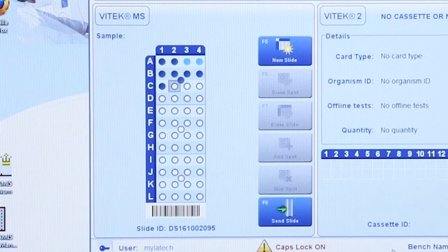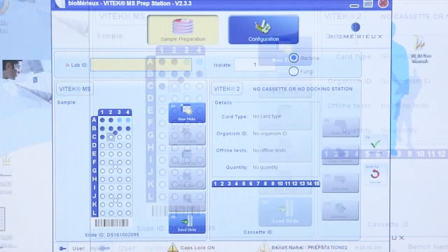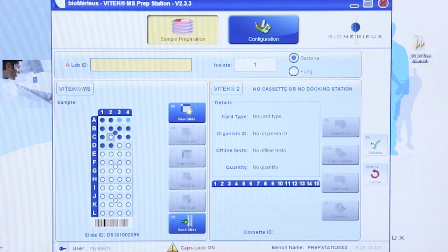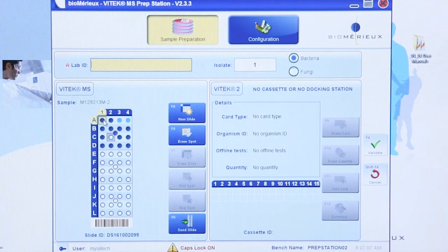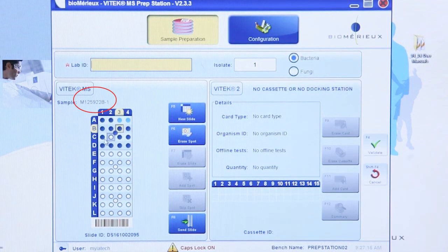The software is programmed to fill the slide in order, left to right and top to bottom. Continue adding specimen information for all isolates to be tested on the slide. Once all spots have been prepared and information entered, it is good practice to verify the data entered. Clicking each spot will display the lab ID and isolate number associated with the spot.